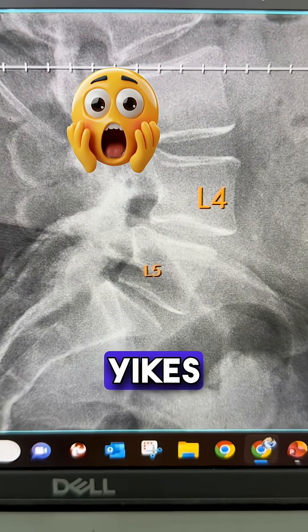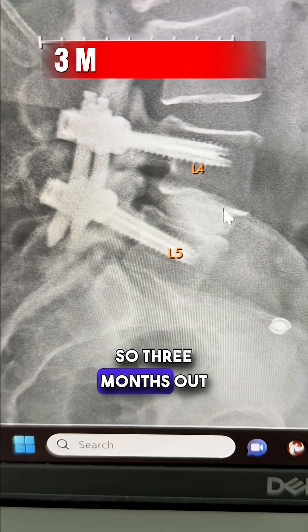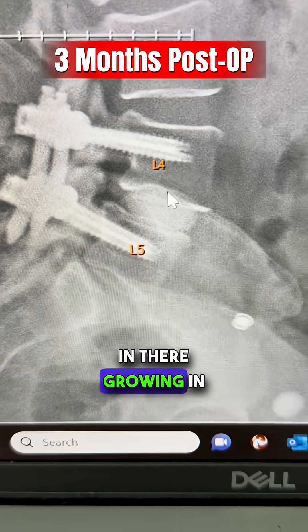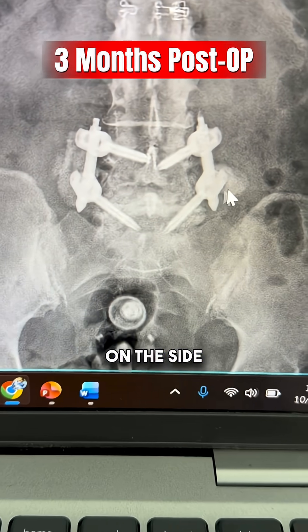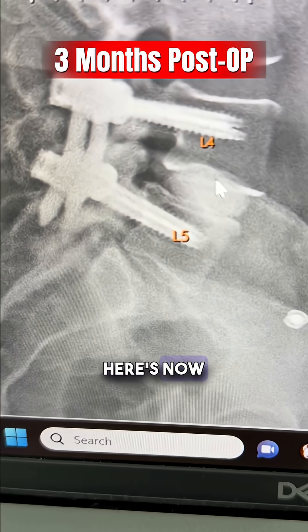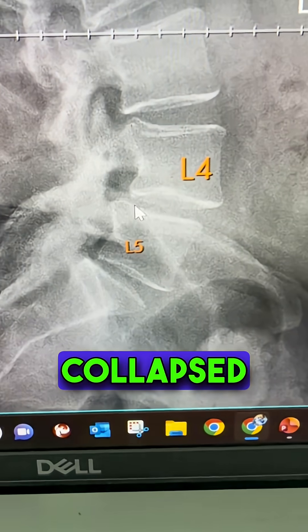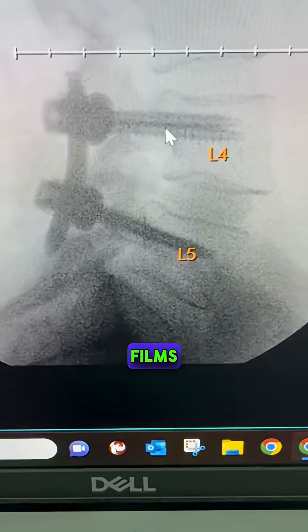Here is the before image — you can see the collapsed disc and slippage of the bone. Here at three months out, the spacer is in there growing in between the bone. You can see the bone graft I left on either side looking great. Here are the intraoperative films showing wide-open nerve tunnels.